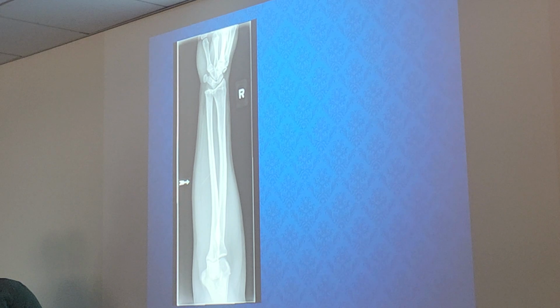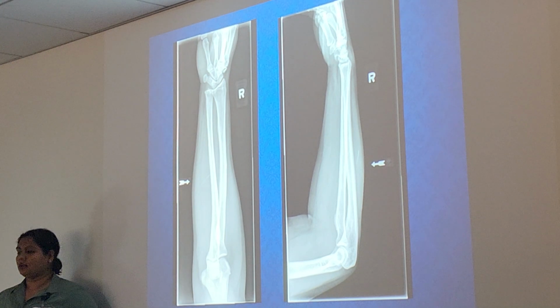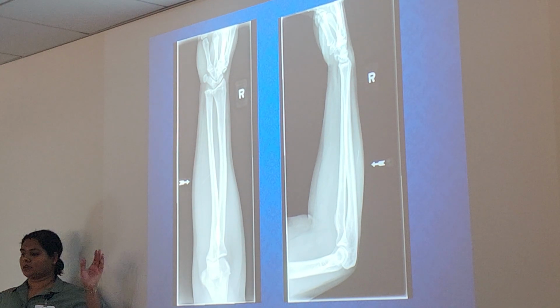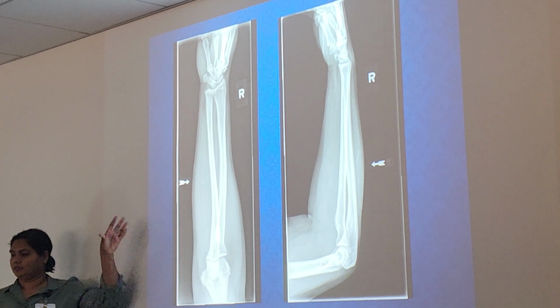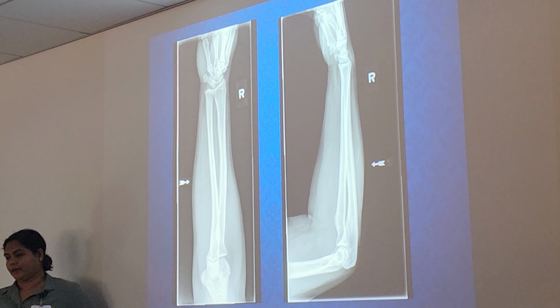And what X-ray is this? AP forearm. It's hung up. That doesn't look like a very good AP though. And lateral forearm is also hung up. You may see some techs hang it horizontally. They flip the arm around, but this is the correct way.